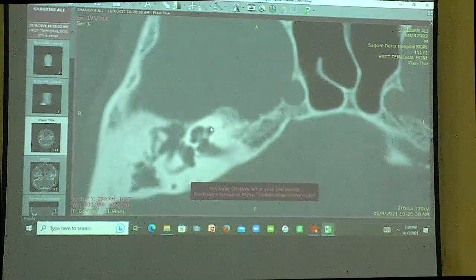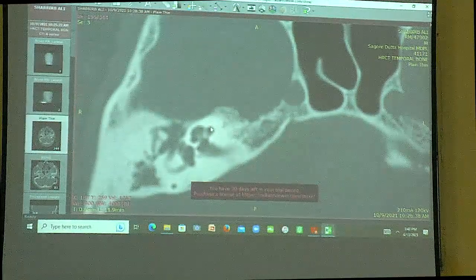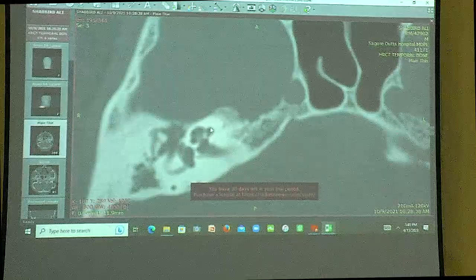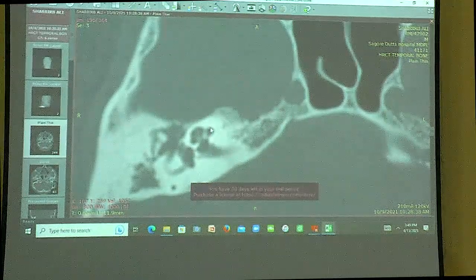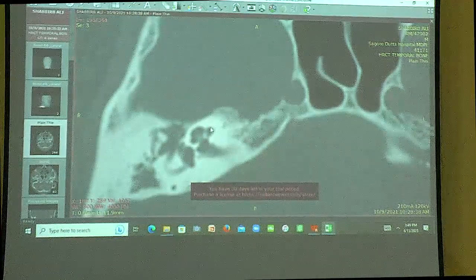The CT scan is acquiring data in 3 dimensions, isn't it? It is taking it as a cube, so that is known as a volume element or a voxel. But when we are seeing it, it is in 2 dimensions, either as a CT plate or as a 2-dimensional image. So the computer compresses the voxel into a pixel. From 3D it goes to 2D.